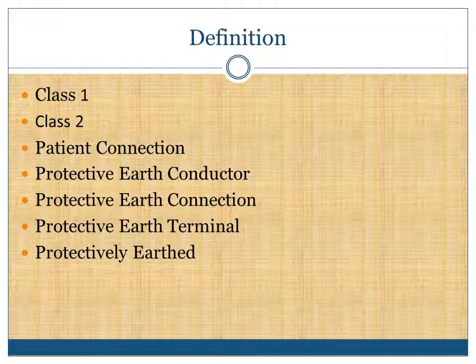Insulation Class 2: a term referring to electrical equipment in which protection against electric shock does not rely on basic insulation only, but in which additional safety precautions such as double insulation or reinforced insulation are provided, there being no provision for protective earthing or reliance upon installation conditions.